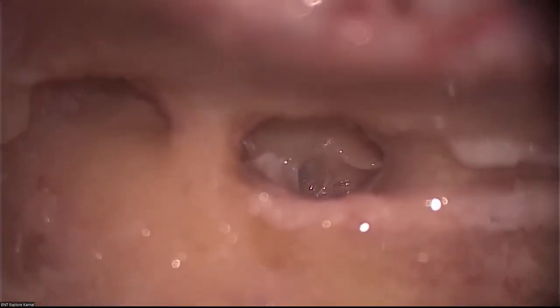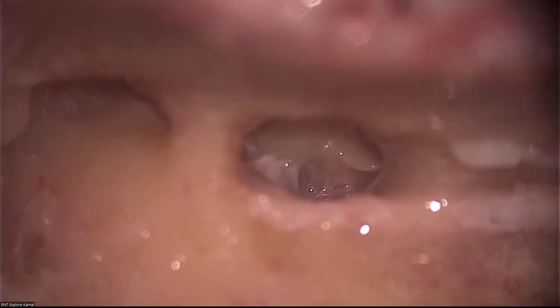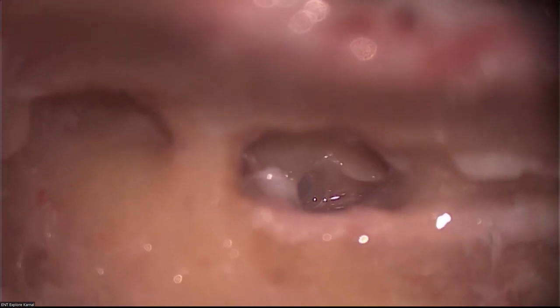Now, look at this. We can see the round window now. Complete round window niche, correct. See the bluish round window and the hypotympanic cell also. The round window membrane is also seen. So this is a favorable round window with hardly any niche. See, a little bit of niche over it. Can you see? Yes, a very small ledge of bone.